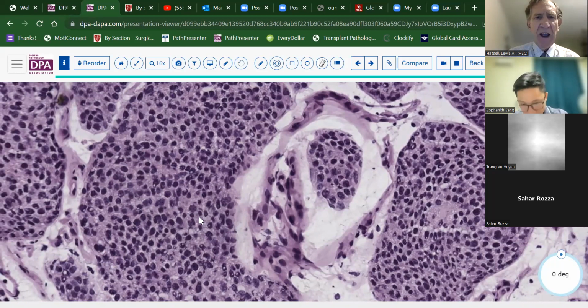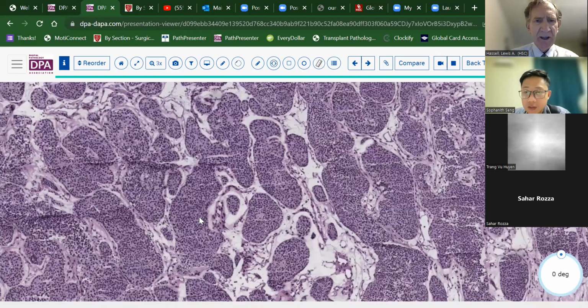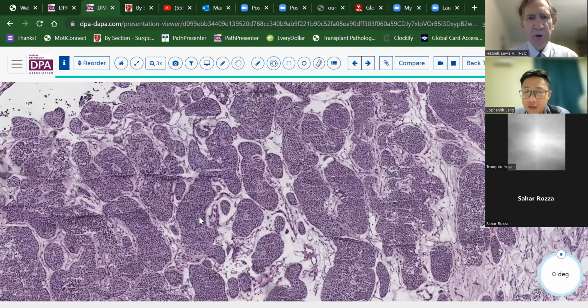And so providing on frozen section an answer like, small blue cell tumor, favor neuroblastoma, or small blue cell tumor, not otherwise specified, await permanents, or something like that, would be an acceptable answer to tell the surgeon that you have diagnostic material. We're going to need some additional workup to fully subclassify it, and we're heading down this pathway of evaluation rather than down a different one.